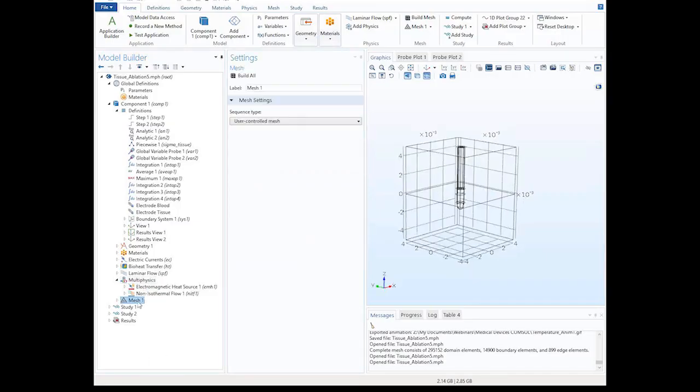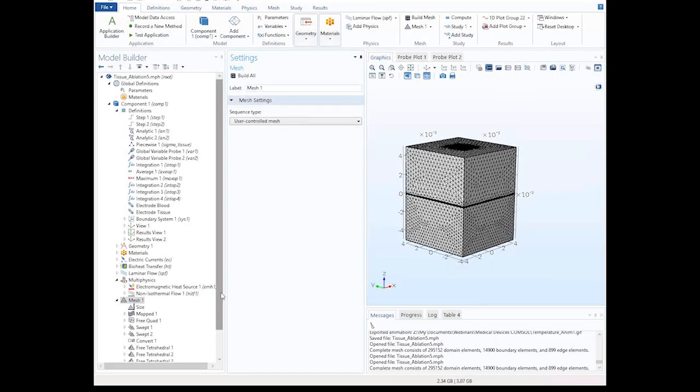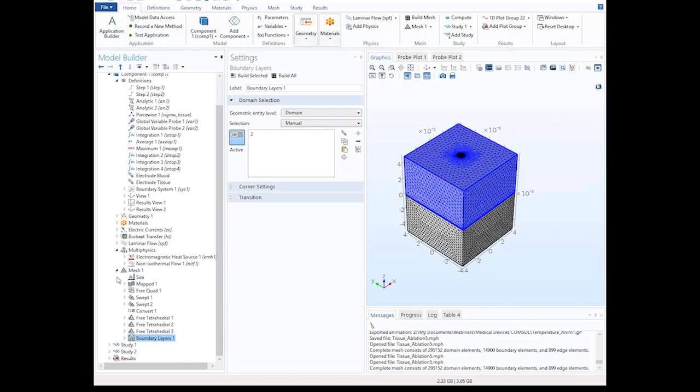Next thing is the mesh. I could have probably just selected the default mesh and been done, but in some cases it's good to have manual control over the mesh. So you'll see the commands here. I made a mesh that's maybe a little bit too fine, but finer here where you need it, a little bit coarser on the outside, with a boundary layer at the edges where there's an interface between solid and blood. Again, a coarser mesh would have been fine, but it was straightforward to mesh that.